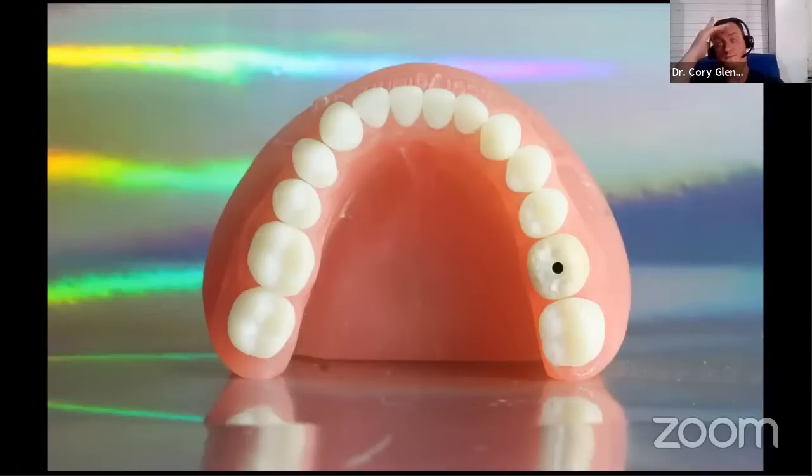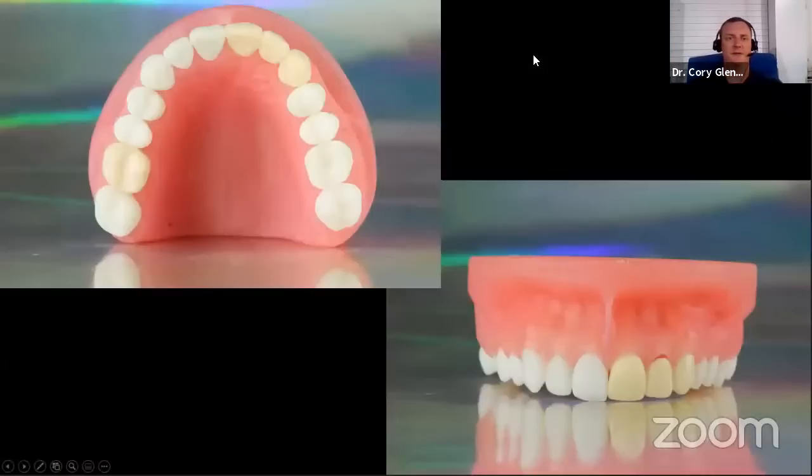So typically what we do is we bury it and then we do a second stage surgery and we put on a healing abutment, and no one's stock healing abutment is shaped anything like a natural tooth. So it ends up healing to this perfect cylinder. And then your crown ends up having that cylindrical shape too, because it's just a backward workflow. Far better way to do this is go ahead and design the final restoration while they're healing with the gingiva covering it. They're protected. And then the final restoration's ready at second stage uncovery. You just deliver the final, or at least a really good temp, and then form the tissue to that. Don't form it to a cylindrical healing abutment, which isn't anatomic. Go ahead and design a restoration and let it be your healing abutment. And you'll find you'll get a lot better soft tissue around your implants. So that's a really useful workflow.